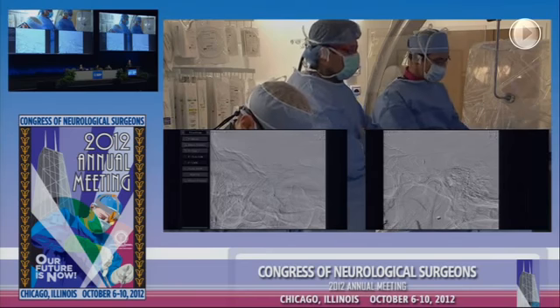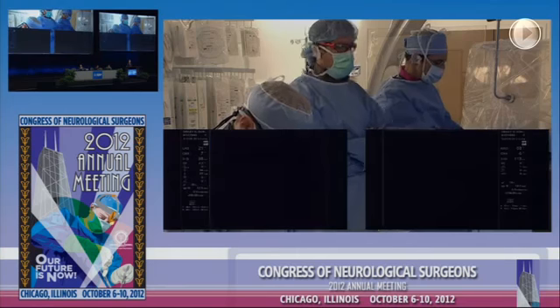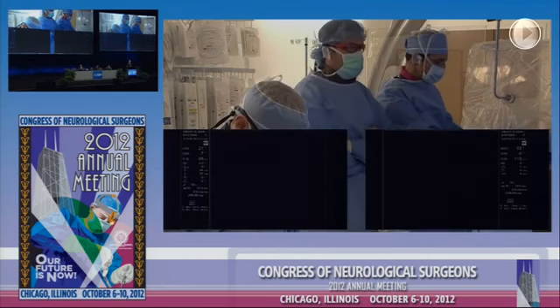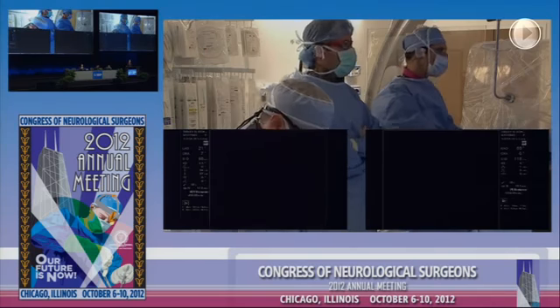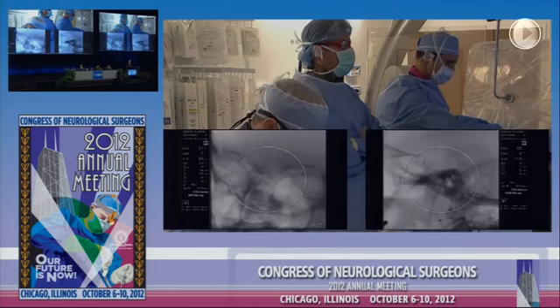Can you show, and you can just see that there's so much less pressure in the aneurysm, and once the heparin wears off, this thing will most likely be occluded. Run, please. Hold your breath, honey. Hold your breath.